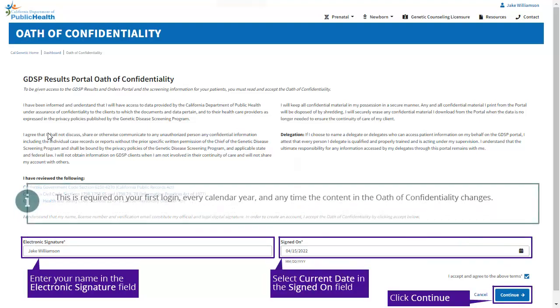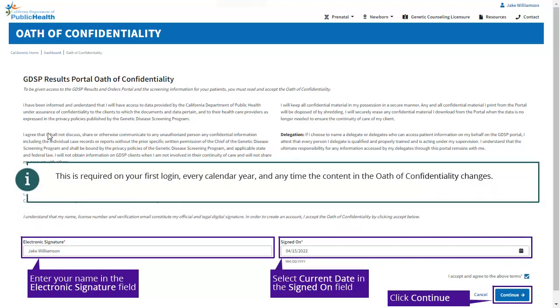This is required on your first login every calendar year and any time the content in the Oath of Confidentiality changes. Once the Oath of Confidentiality has been submitted, you will be navigated to the Select Provider screen.